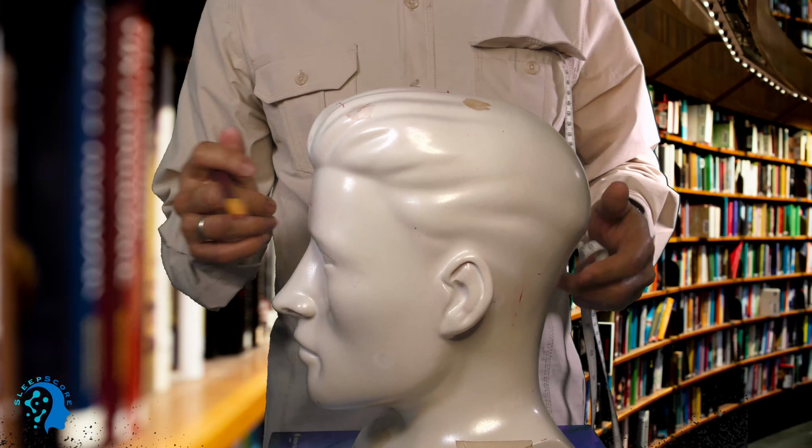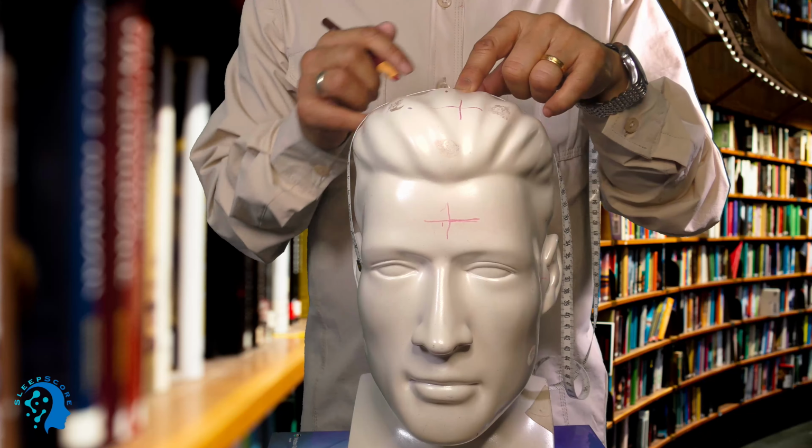Now we can do from pre-auricular, and the pre-auricular is you have to measure like this, the little indent. This one is pre-auricular. From here to the other side. Okay, this is pre-auricular. So what you're going to do is measure from the center point to the pre-auricular. So I got like 36, and I'm going to mark half of 36, okay?